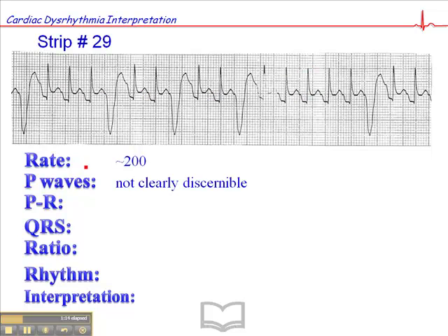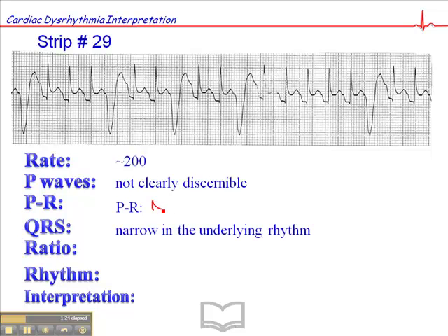The PR interval — since P-waves are not really clearly discernible, we don't see the beginning and end of those P-waves. The PR interval should read not applicable, so I'll write that in there and cross that out.